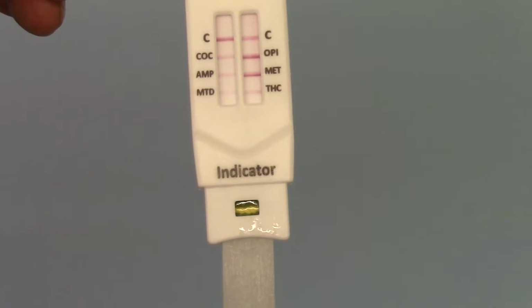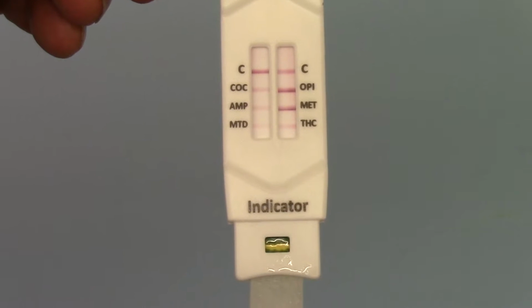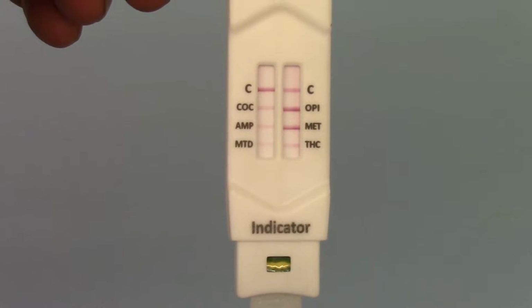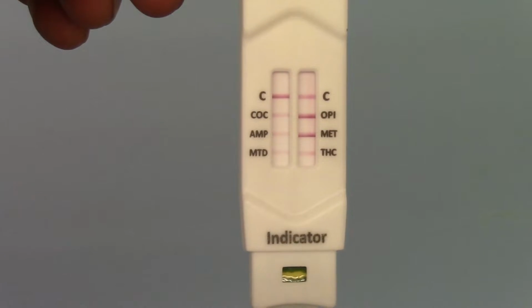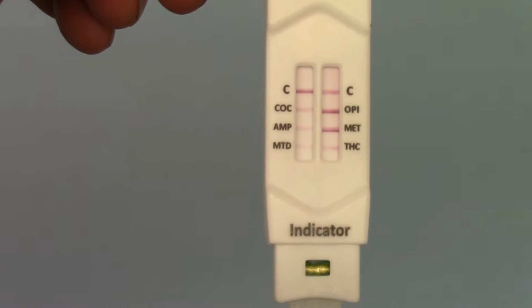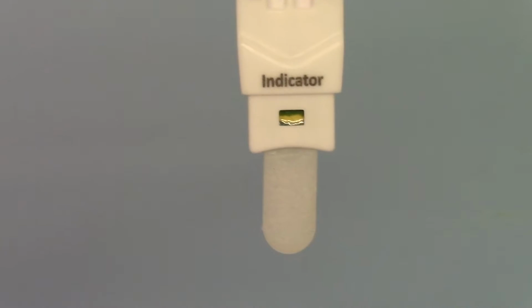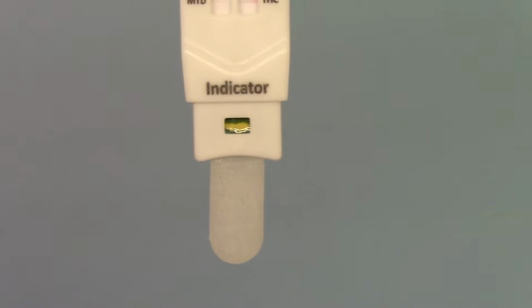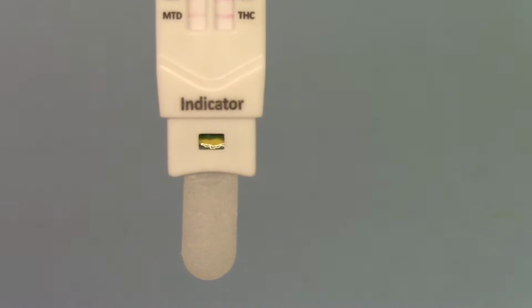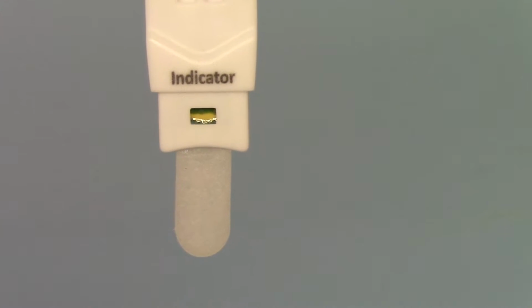We're showing you now the saliva indicator partially turned blue, but there has already been sufficient saliva absorbed to run the two test line membranes right up until the control line. It hasn't completely turned into a white background yet. What you will see is that the saliva indicator is quite slow to change in these tests. That's as a safeguard to ensure that you've really saturated and collected more than enough saliva in that membrane to run all these tests.